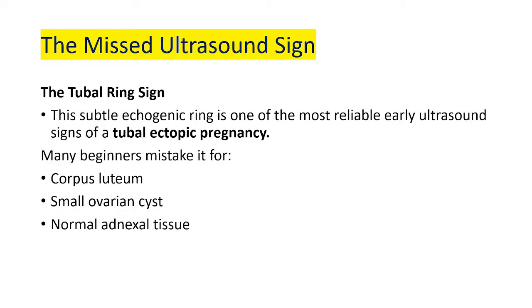So, let me explain the findings. Did you get it right? So the missed ultrasound sign is the tubal ring sign.